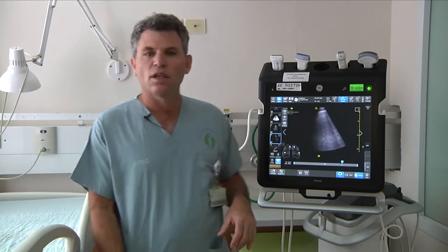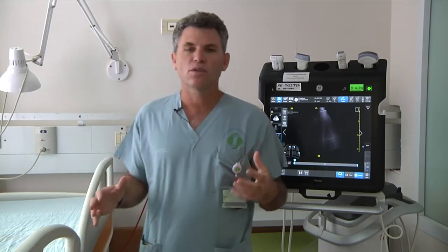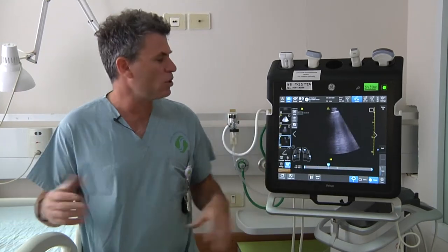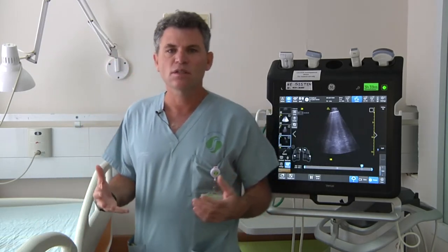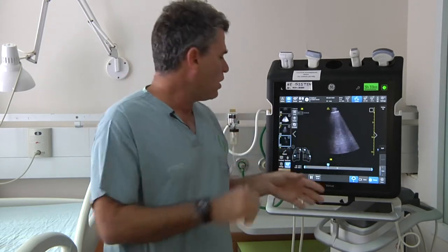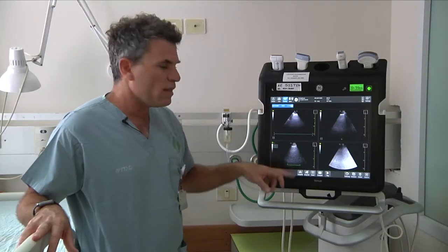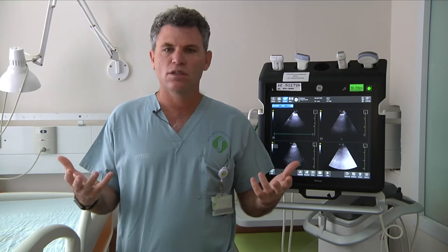The ability for every scan, every day, to mark exactly where you found your pathologies is also very helpful. Later on, when the patient gets worse — today, tomorrow, or two days forward — when you come back and scan the patient again, you know exactly where the pathologies were, and you can compare the current findings with those from two days before, all by comparing side by side the lung findings and the marks on the lung map.